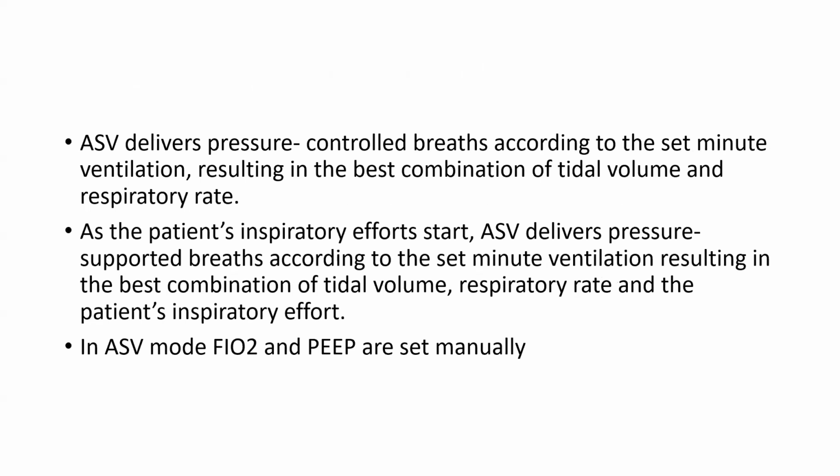ASV delivers pressure control breaths according to the set minute ventilation, resulting in the best combination of tidal volume and respiratory rate. As the patient's inspiratory efforts start, ASV delivers pressure-supported breaths according to the set minute ventilation, resulting in the best combination of tidal volume, respiratory rate, and the patient's inspiratory effort. In ASV mode, FiO2 and PEEP are set manually.